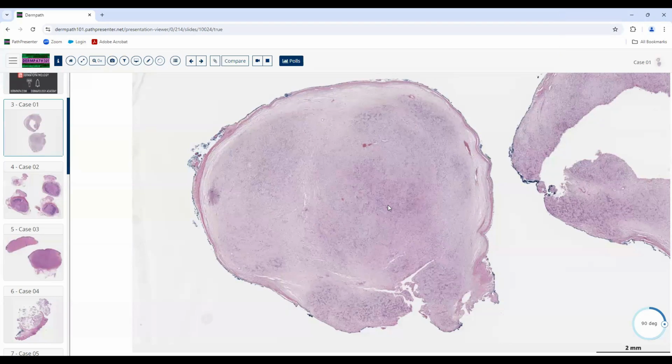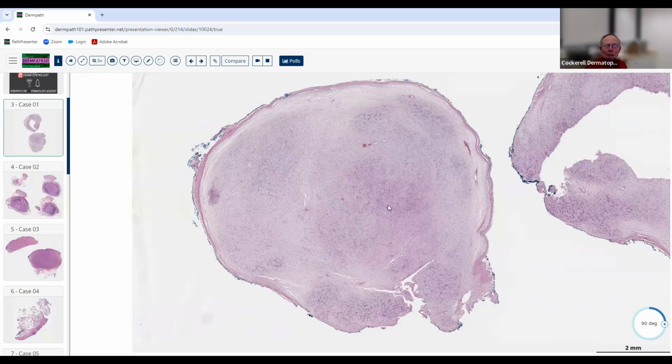Okay, maybe neural, muscular. Good, and there's one more. Maybe follicular? No, that's another adnexal one. The last one is fibrohistiocytic. Those are the three main spindle cell lesions you're going to encounter in dermatopathology. There are others, like I mentioned, but those are the three major ones I want you to focus on.